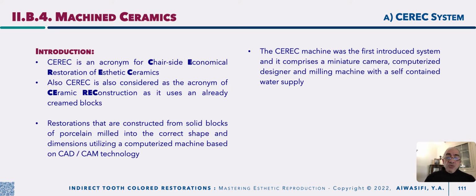It was the first to introduce the copy milling idea using CAD/CAM technology. Its components are a miniature camera, a computerized designer, which is software like Photoshop, and finally a milling machine, equivalent to the printer for a graphic designer.